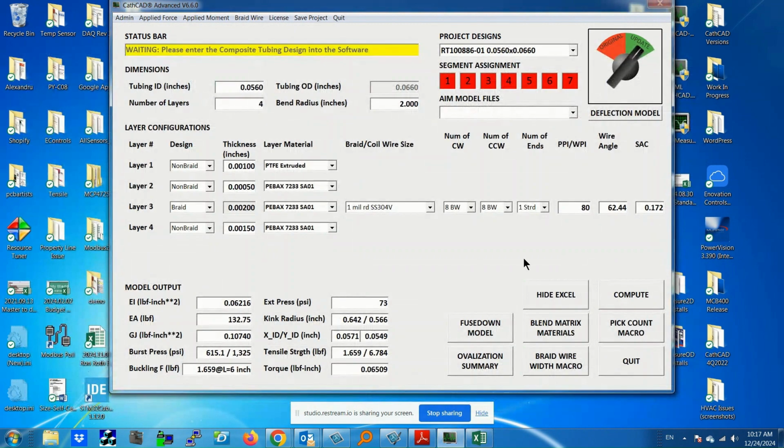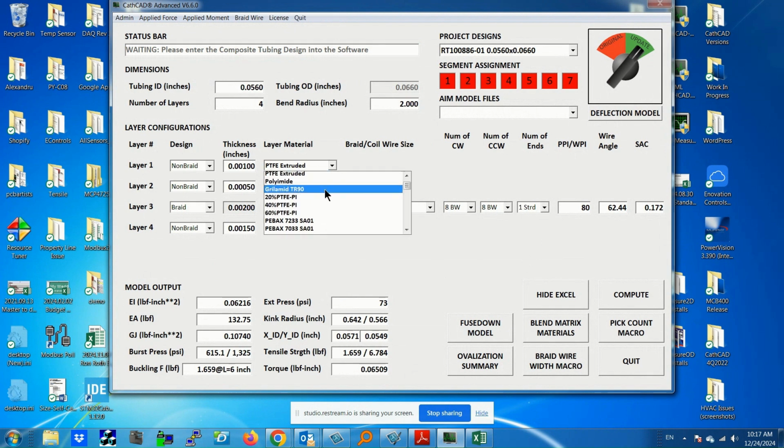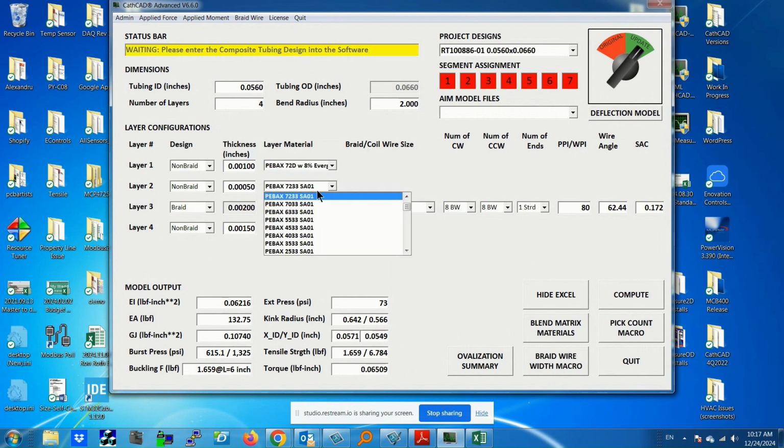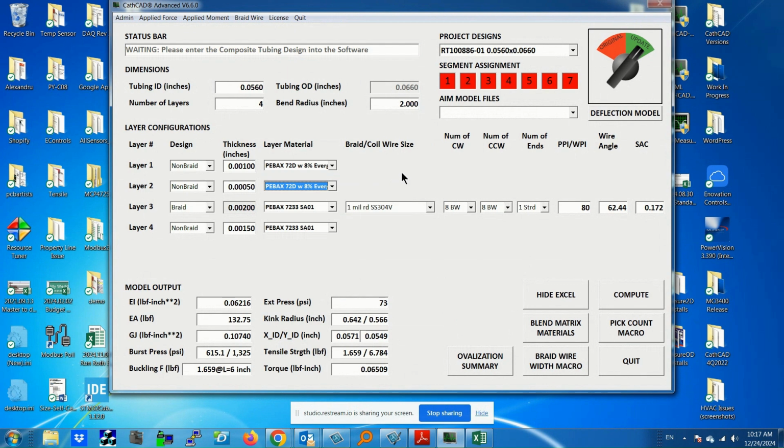So then, Steve, you brought up this concept with the issue with PTFE potentially being minimized. So we're going to look at replacing this extruded PTFE layer with a lubricious PEBAX material. We're going to pick PEBAX 72 with 8% EverGlide. Okay. Excellent. And we're also going to replace this tie layer with the same thing because it doesn't make any sense to do the same. So again, just like that, we've made 2 clicks and we've changed our design. And as you stated, Steve, we want to compare these 2 designs and see how they compare.